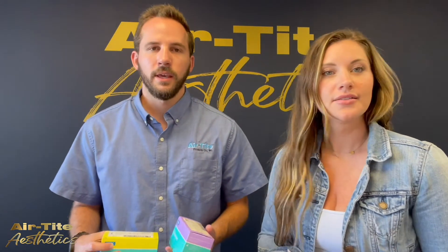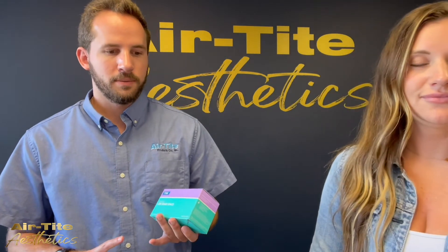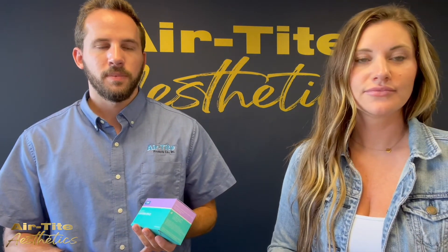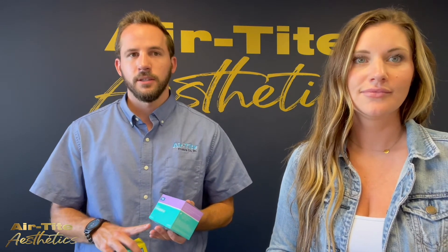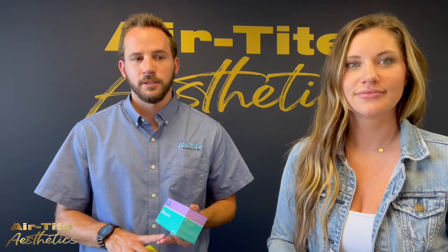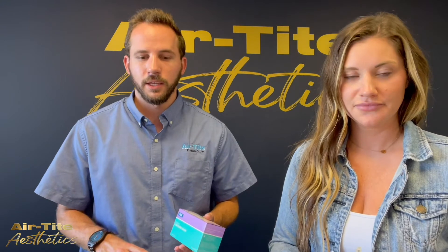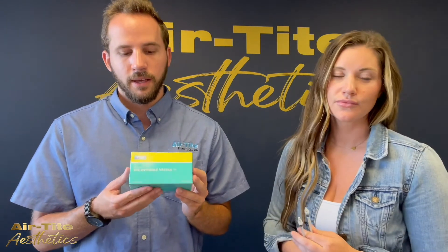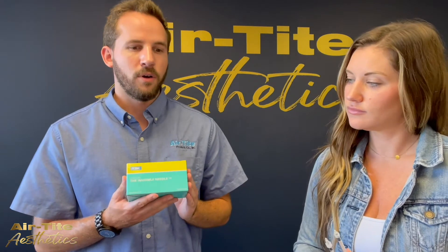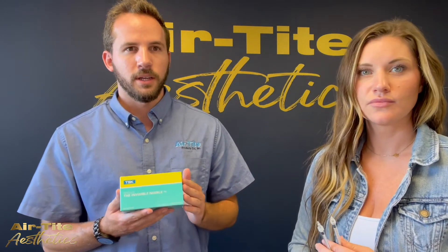So these come in a variety of sizes. Currently we carry a low dead space needle that is 30 gauge by 13 millimeters, a 33 gauge by 13 millimeters, and a 33 gauge by 9 millimeters. Soon we're going to be getting a 32 gauge in. We also have the invisible needle, which is the smallest needle that TSK has ever invented — it's going to be smaller than the 33 gauge needle and falls right in between the ISO standards of a 33 gauge and a 34 gauge.